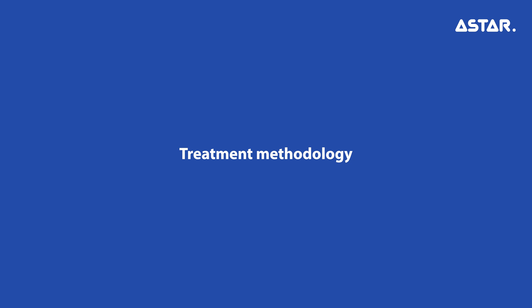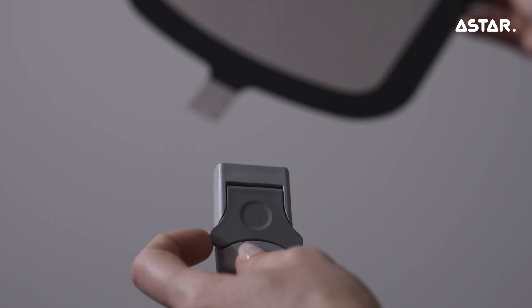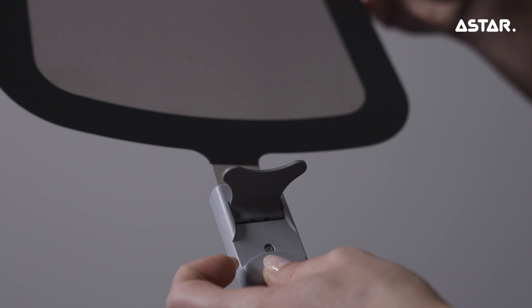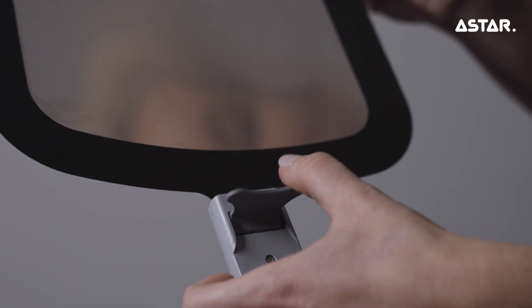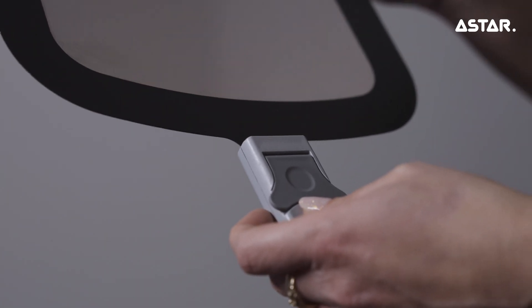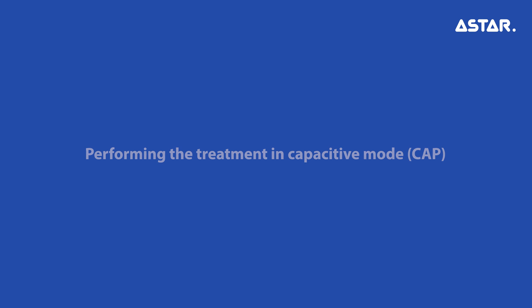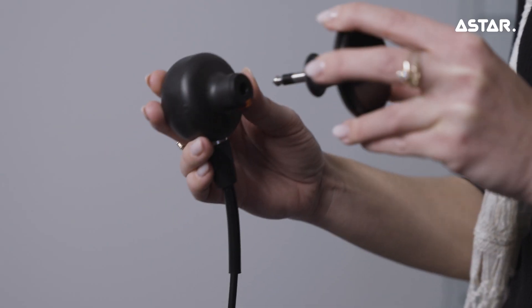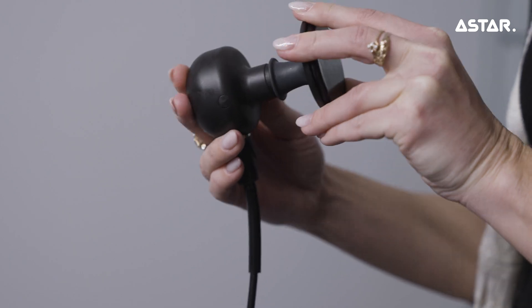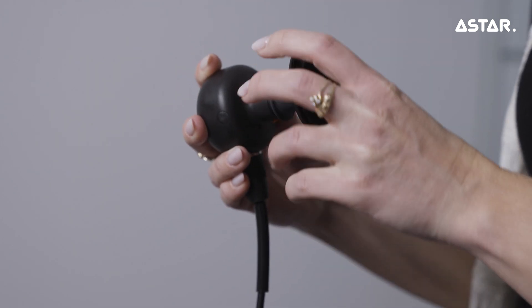Treatment methodology: Connect the neutral electrode to the cable with the clamp and place it in the right position, or attach it with Velcro belts to the patient's body. Performing the treatment in capacitive mode (CAP): mount a capacitive active electrode in the angular applicator.